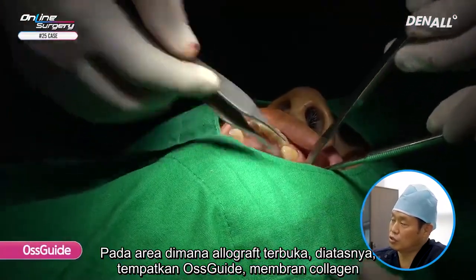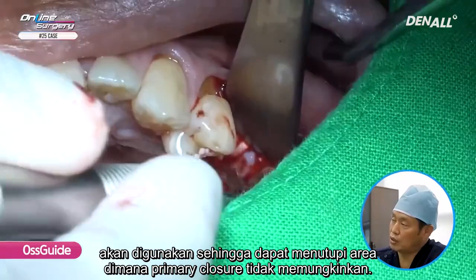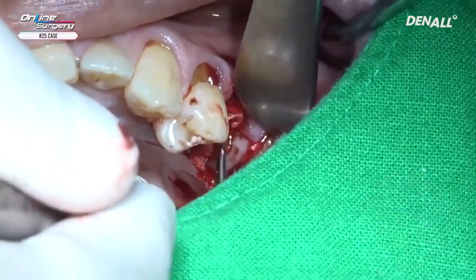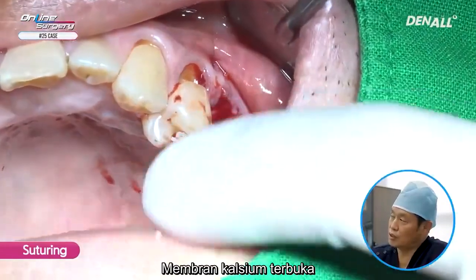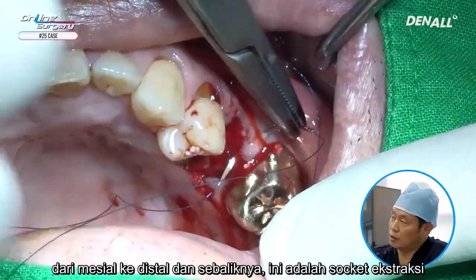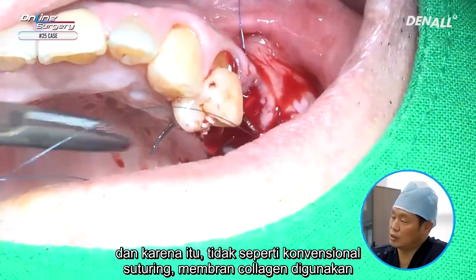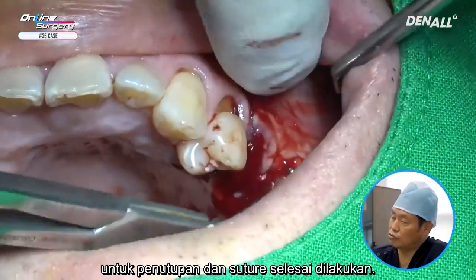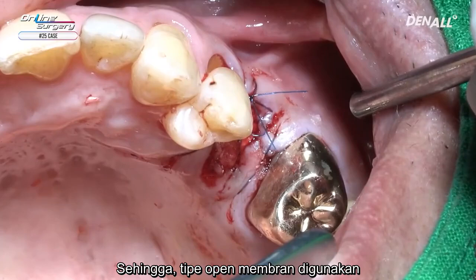In areas where allograft is exposed, on top of it, Os Guide, the collagen membrane, is going to be used so that it is covered where primary closure is not possible. The collagen membrane is exposed. Hidden X suture is going to be done from mesial to distal and the other way around. This is the extraction socket, and therefore, unlike conventional suturing, collagen membrane was used for coverage and suture was done. As a result, a type of open membrane technique was used.